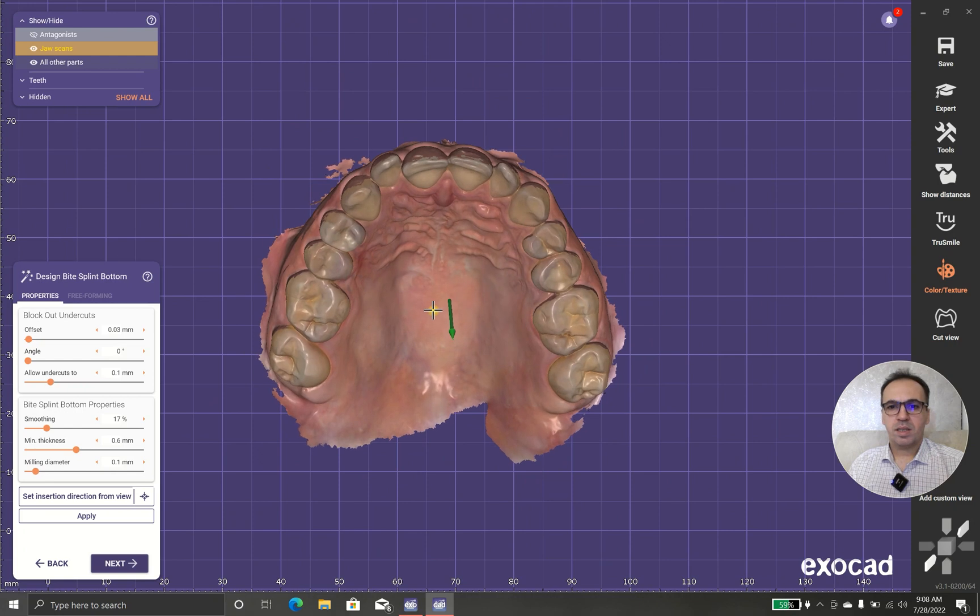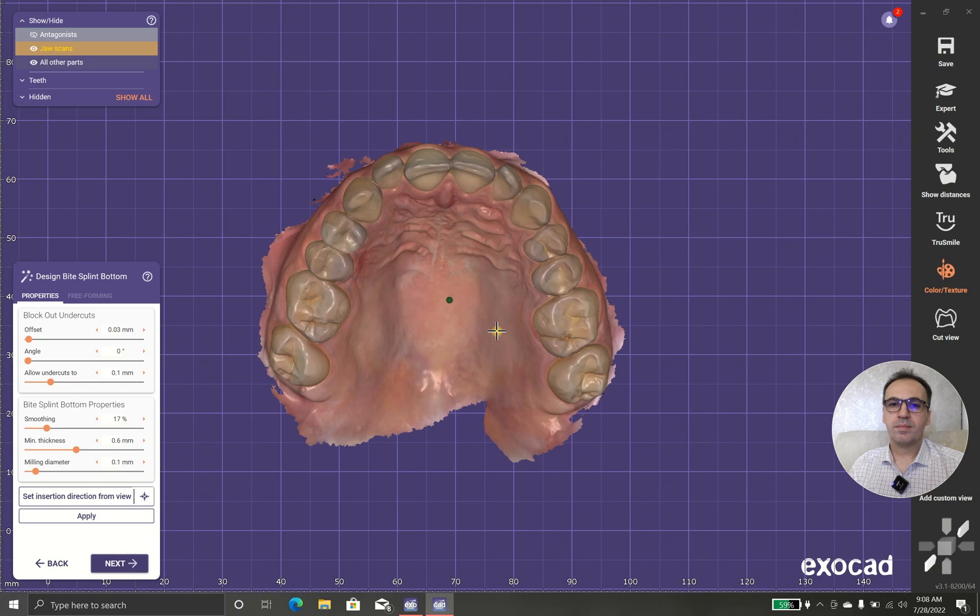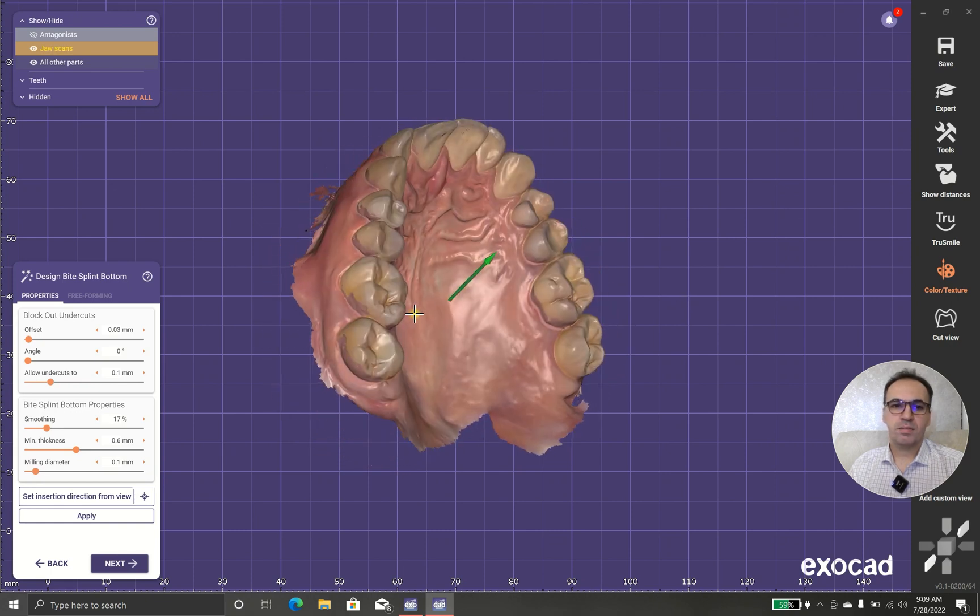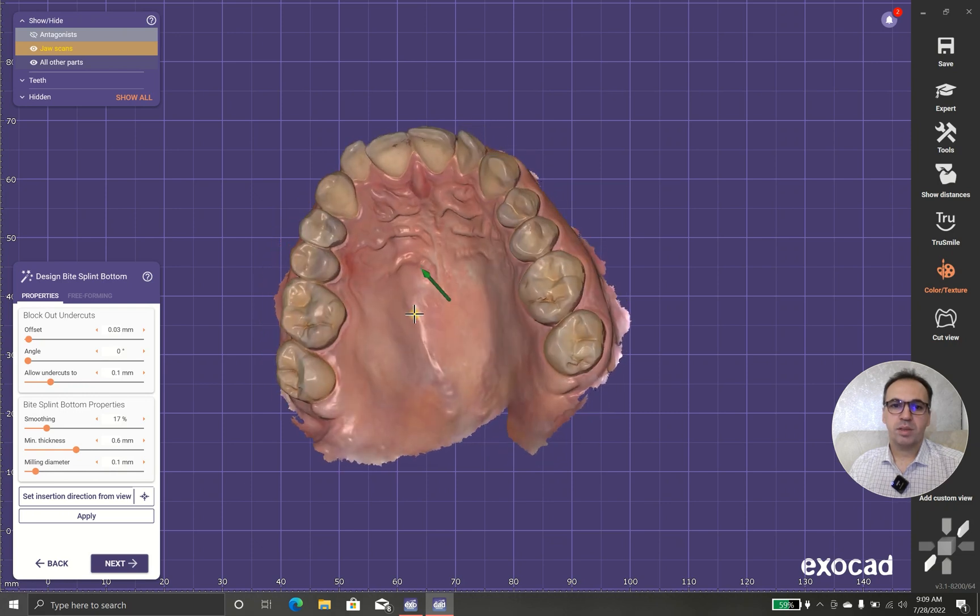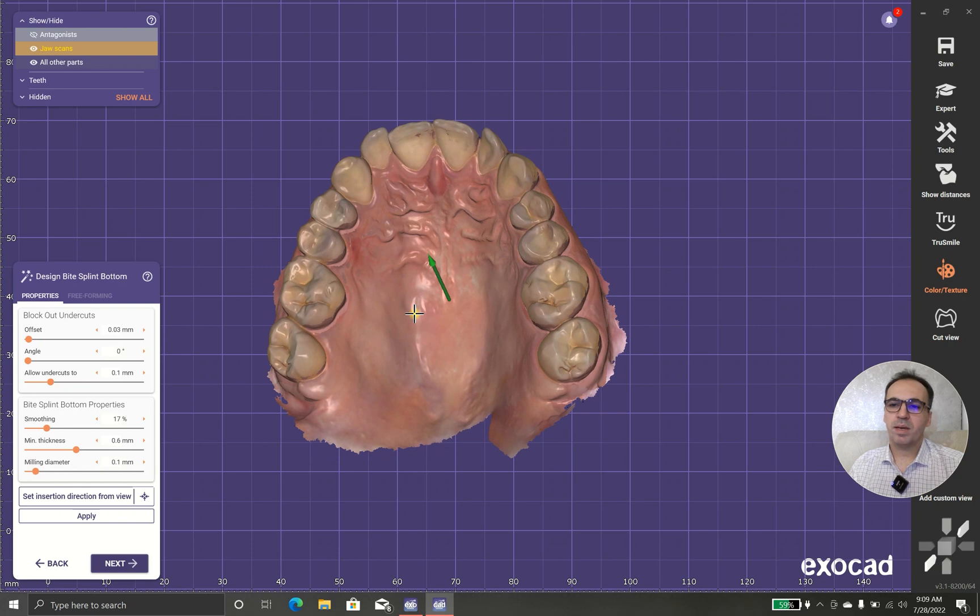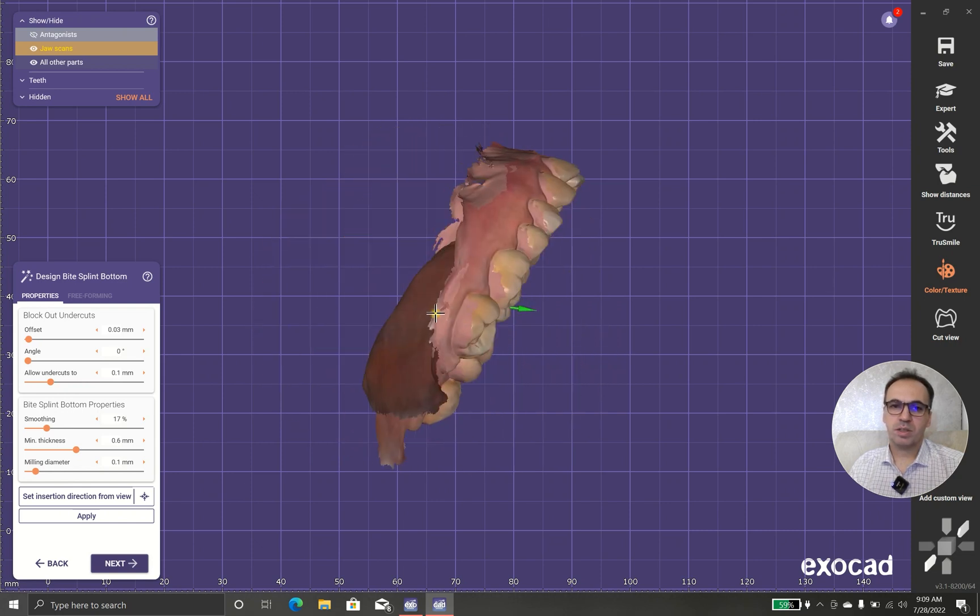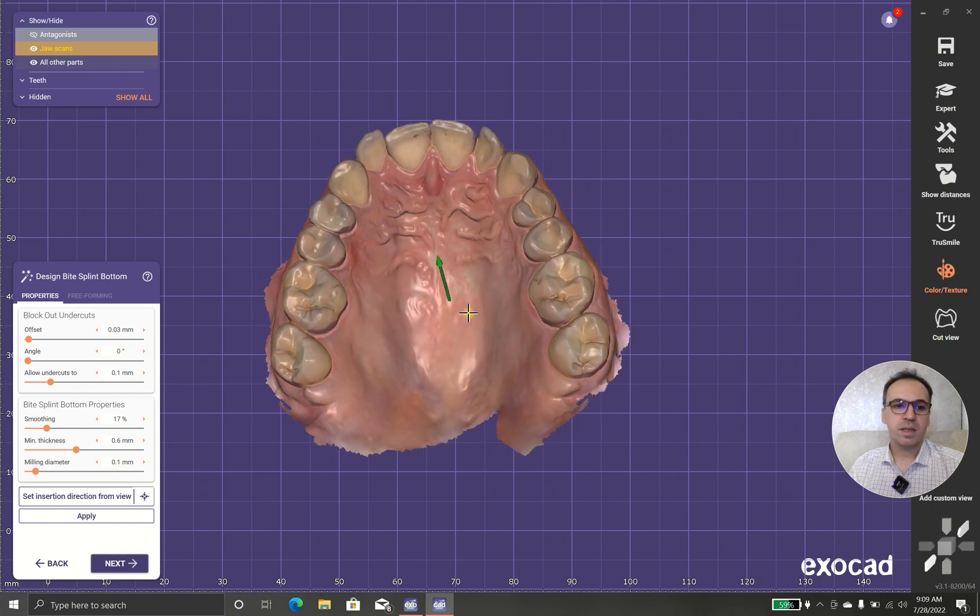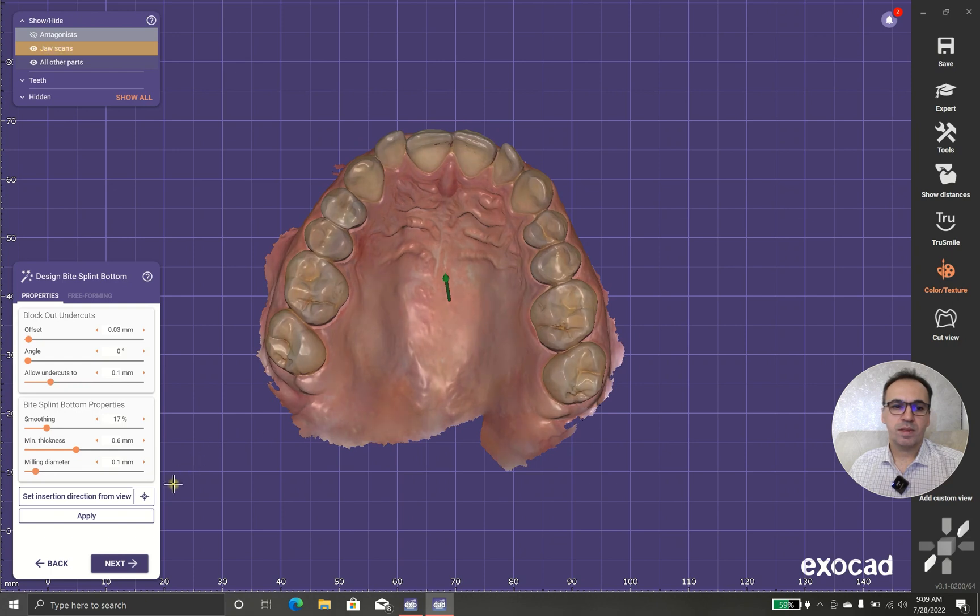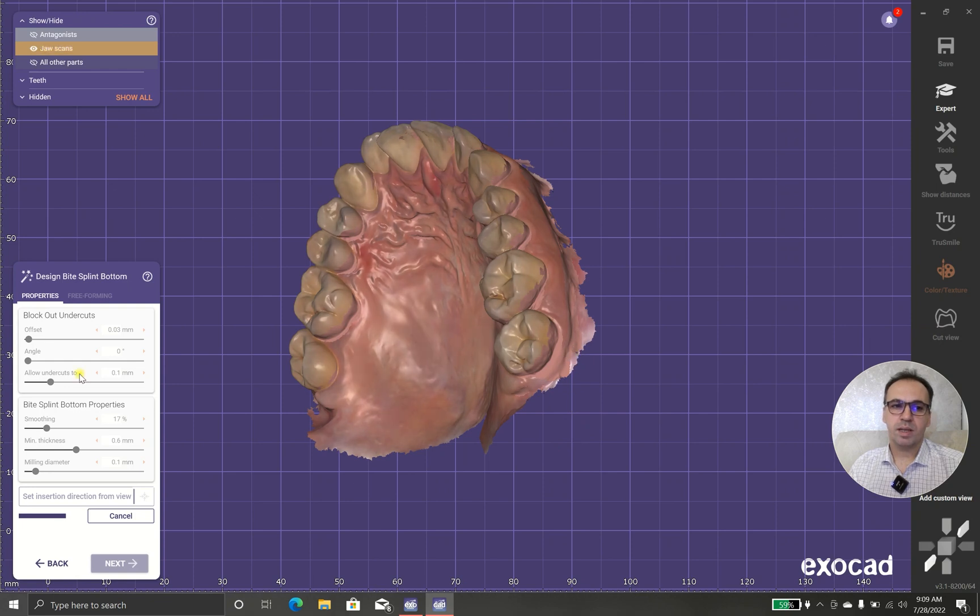In this case, I prefer the direction that is less material gets blocked out. What do I mean by less material gets blocked out? You can see these pink parts are getting blocked out with the wax or virtual wax. In this case, we have space between this part of the tooth and the blue cut material. So, let's see what's happening.